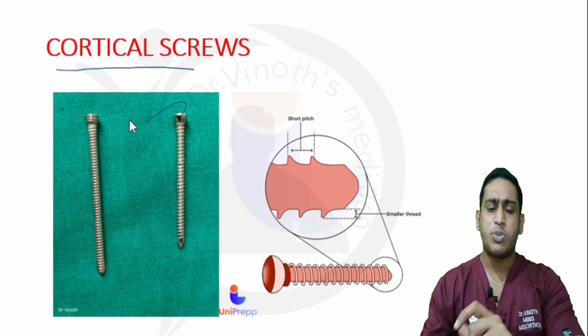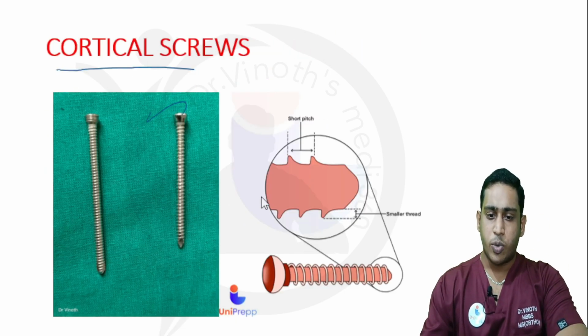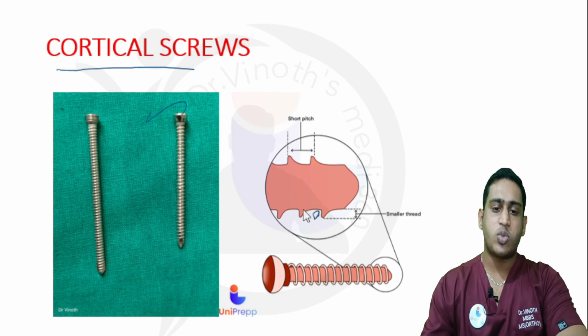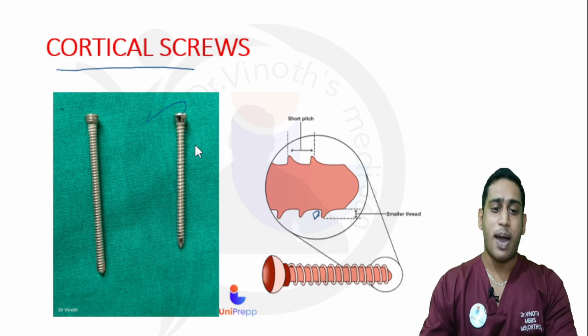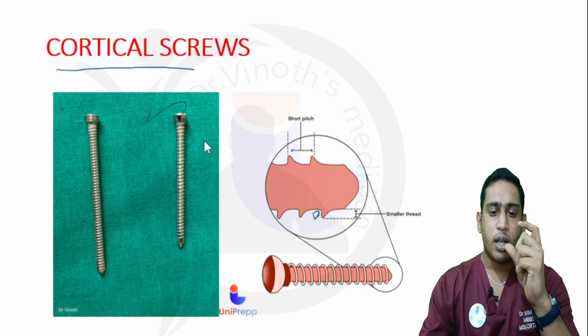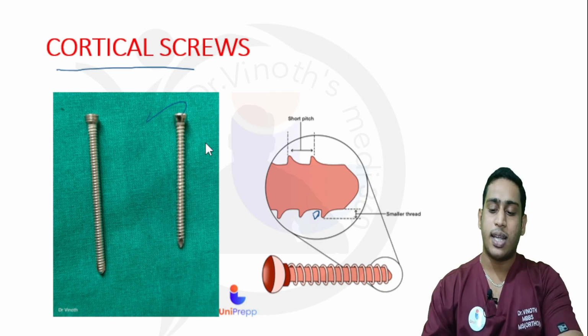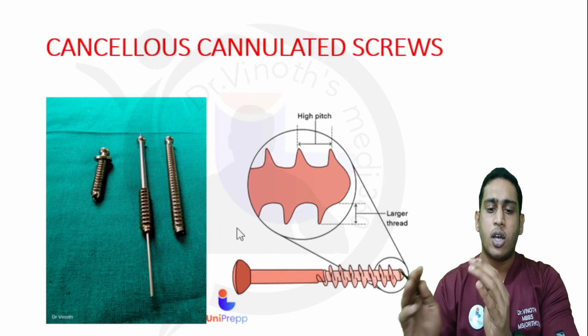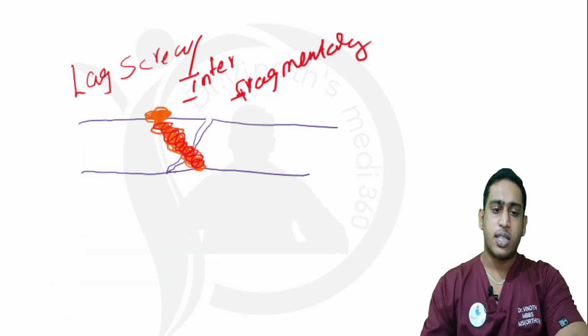What is the difference between a cortical screw and the other variety, the cancellous screw? See, in the cortical screw the thread height is very small, and the gap between one thread and the next is also very minimal. As you can see, the threads are very tightly packed in the cortical screw. On the other hand, in the cancellous screw the threads are somewhat loosely spaced out. Then coming to the purpose, this is called the lag screw principle or interfragmentary screws.